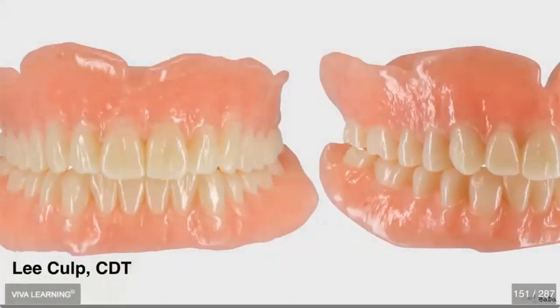They're very nicely polished. You notice that there are no voids between the teeth. The teeth are in one piece, and they are bonded to the base. And you can see here the natural appearance of these dentures and how nicely they look. Again, the adaptive occlusion has been done, so the dentures should be balanced at that time.